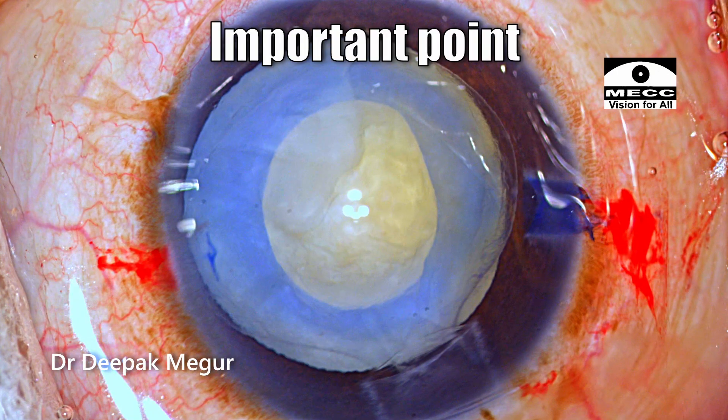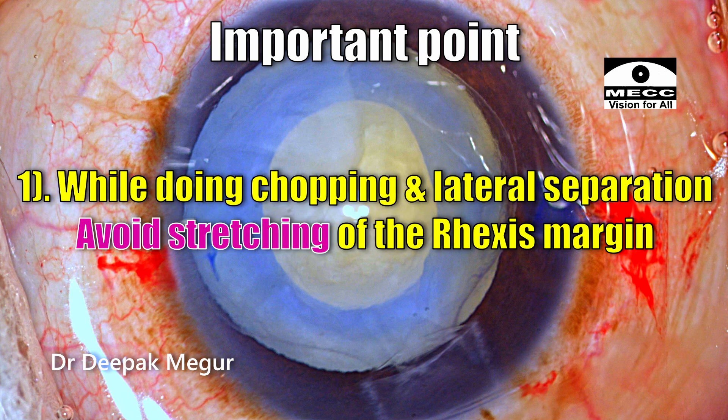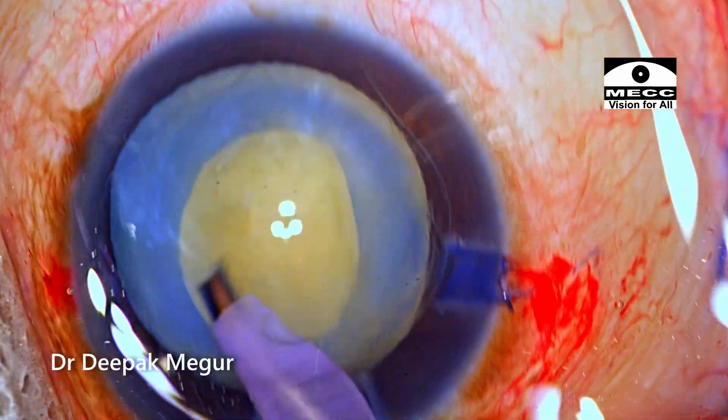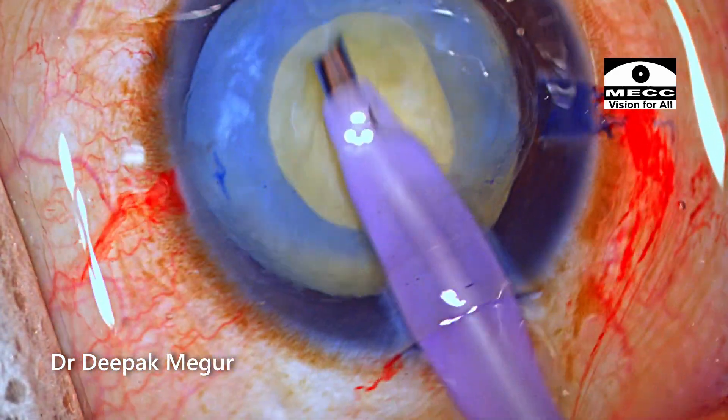When you're trying to phaco in such a small rhexis, there are a few points to keep in mind. When you're trying to chop the nucleus and do lateral separation, there is always a chance that inadvertently the chopper during the lateral separation maneuvers could be tugging at the rhexis margin. That has to be avoided because these capsules will be very thin and flimsy and they can just tear even with the minutest drag.